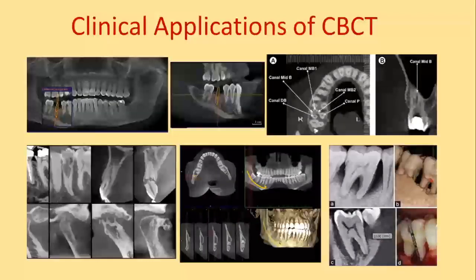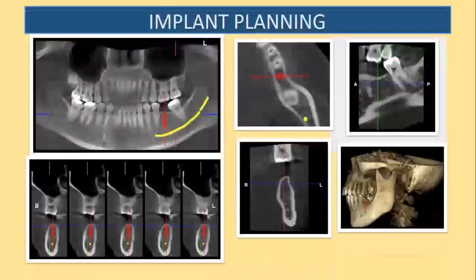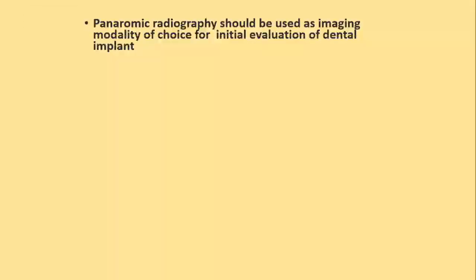But there are some rules to it, and these rules we learned from prosthodontists, from surgeons, from periodontists, about what they want. So let's look at implant planning. I'm using a different software here. However, at the end of my lecture, you'll be introduced to the software Chesa uses. Unfortunately I'm the academician, so I just want you to go through some recommendations very quickly by the American Radiology Association.